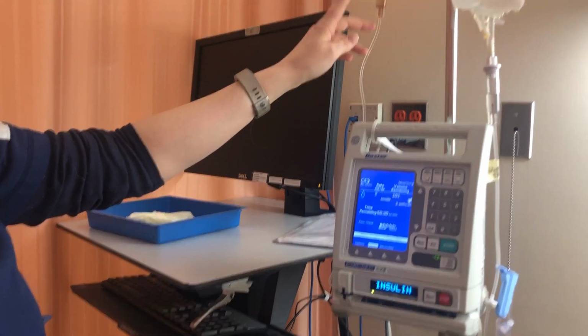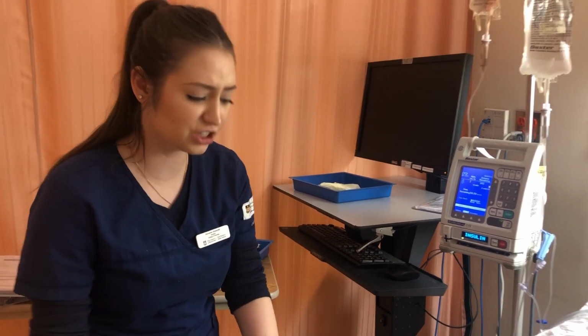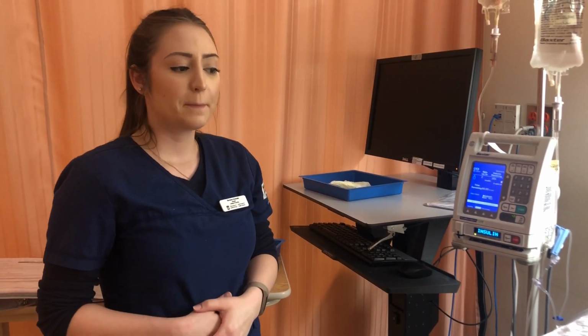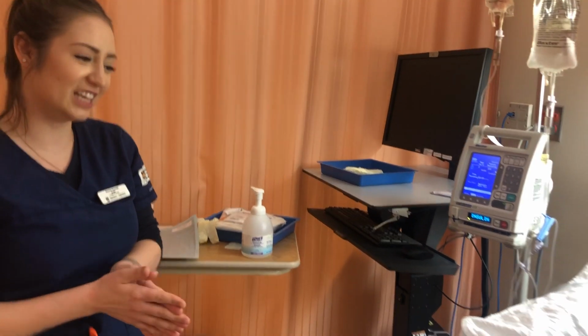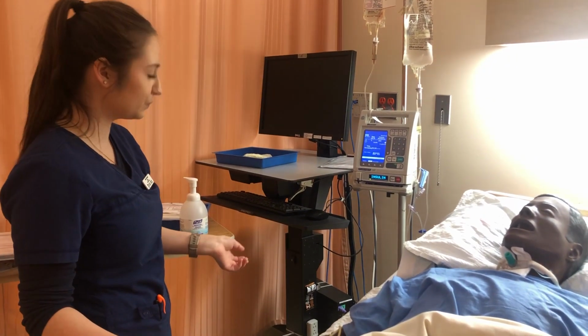So I'm watching for 3 drips, and once those 3 drips are running, I know that it's running into my patient. So I'm going to make sure that I document that I've given the insulin, and I'm going to come back and evaluate my patient, make sure they're not having any adverse side effects. Mr. Scotlan, if you're feeling any kind of dizziness or lightheadedness, please let me know right away and we can get that sorted out for you.